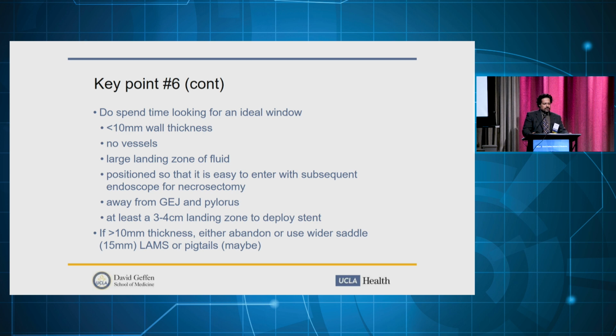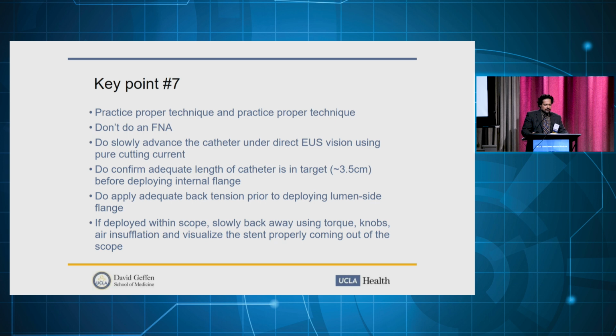There are wider saddle stents for thicker walls, and occasionally you may have to go back to the old style of pigtails over wire. Steve's favorite way of doing it. Practice proper technique, meaning that you should do things well, but also do it repeatedly in an animal model or in our hands-on station. We have a fine expert here, Dr. Sethi, who will help you get a handle on these in the hands-on. Take advantage of that so that it's relatively ingrained how to deploy these things.